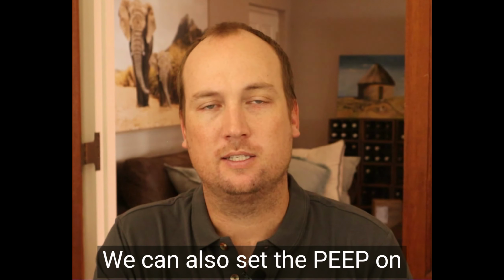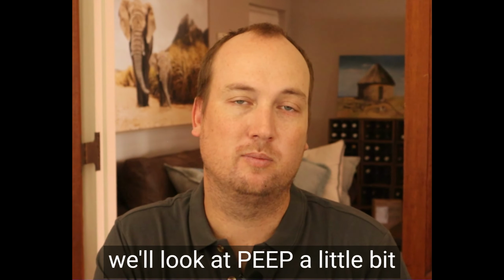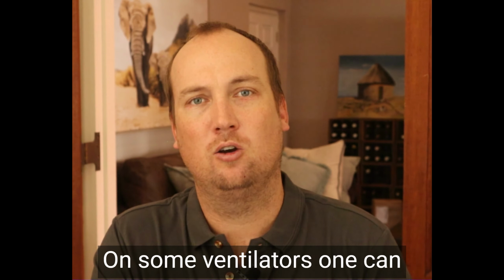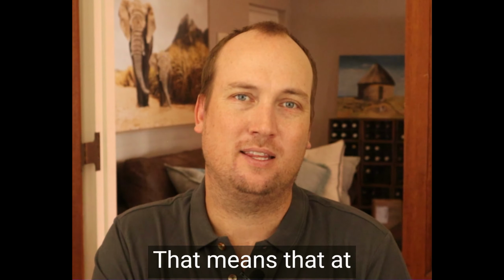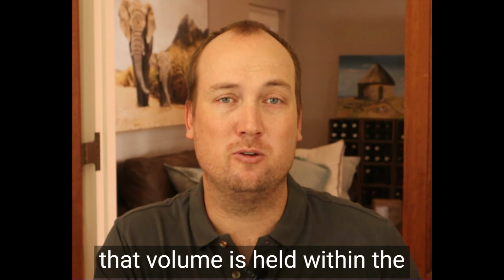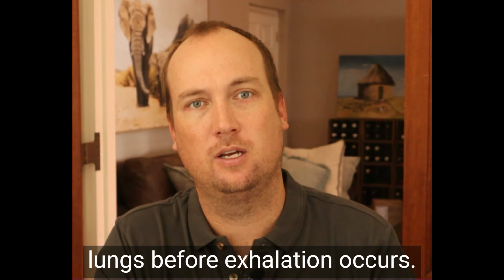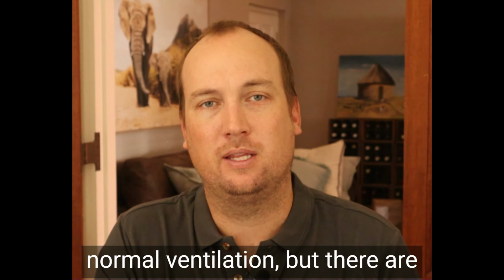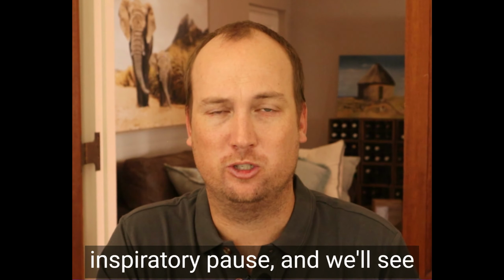We can also set the PEEP on this ventilatory mode, and we'll look at PEEP a little bit later in this video lecture. On some ventilators, one can add an inspiratory pause. That means that at the end of inspiration, there is a slight pause where that volume is held within the lungs before exhalation occurs. It's not normally needed for normal ventilation, but there are some anesthetic workstations that default to having an inspiratory pause.